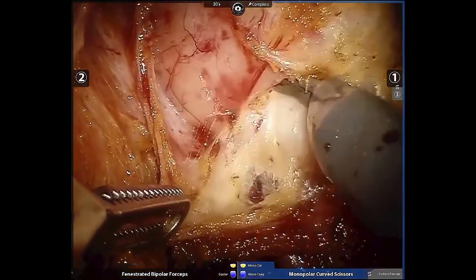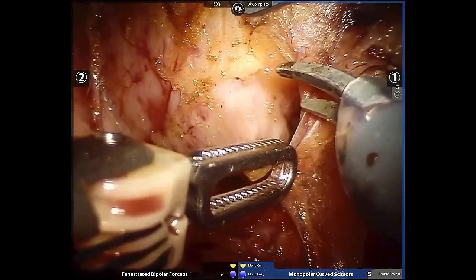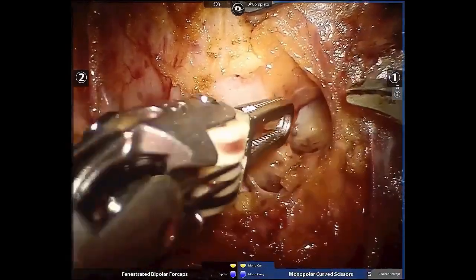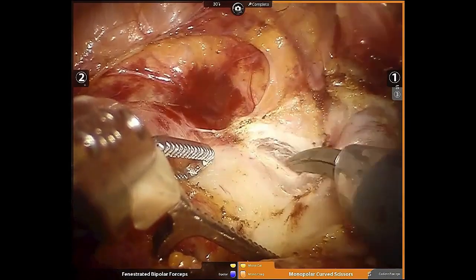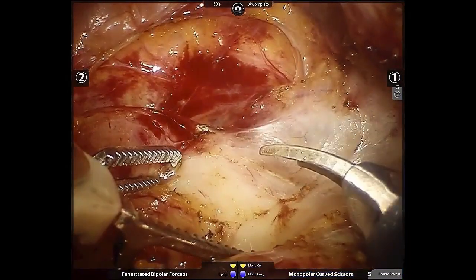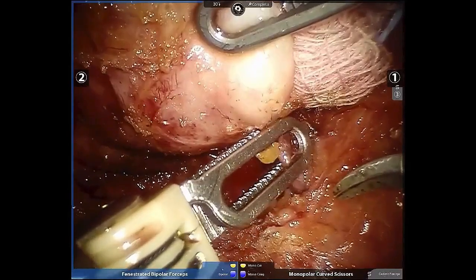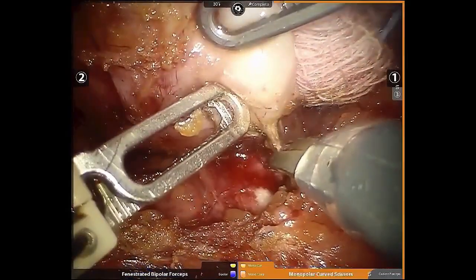The posterolateral aspect is progressively dissected. The likely vascular pedicle of the tumour is identified. Lateral release of the tumour is performed along its capsule to ensure the preservation of the right sacral roots. The nutrient pedicle of the tumour is addressed through progressive cauterization.